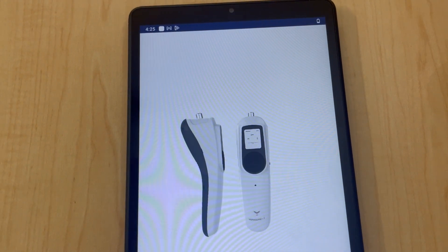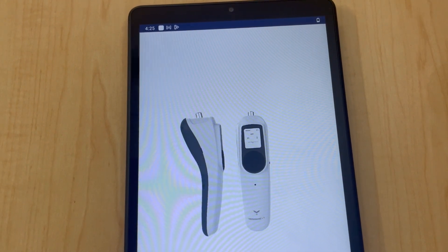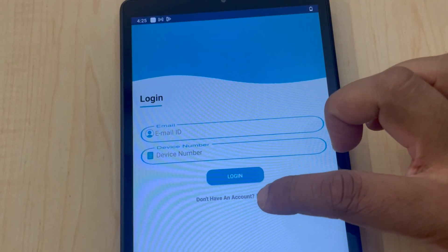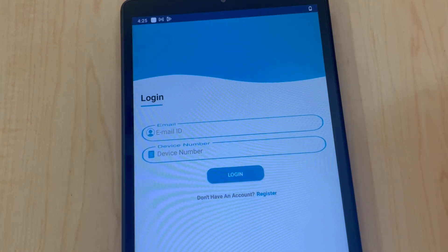When prompted, enable Bluetooth and GPS permissions for the app. Switch on the VibraSense Plus T device during registration.